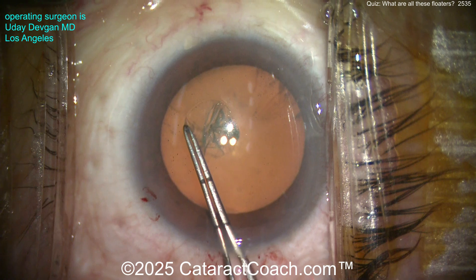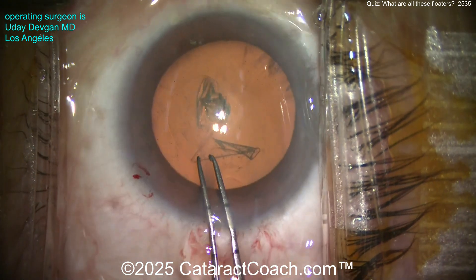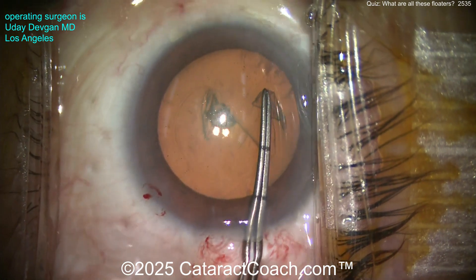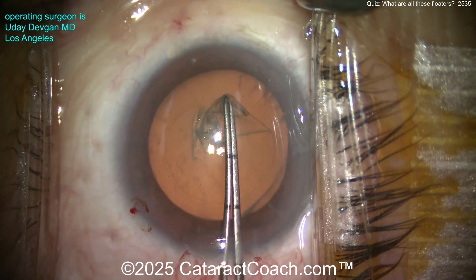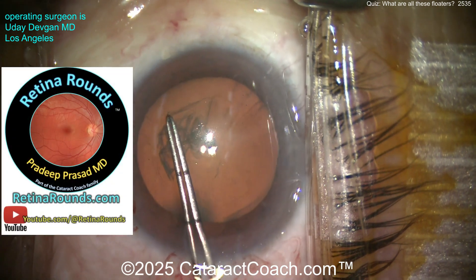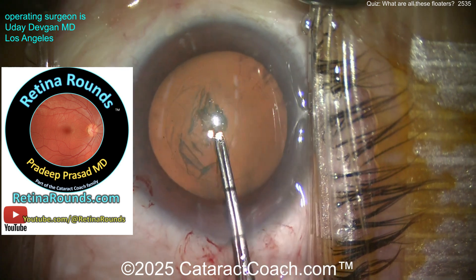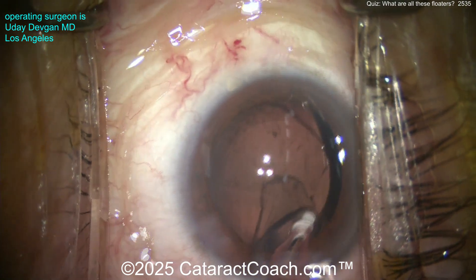That's loose zonular support — that's what that is. Now look in the vitreous; you can see through this cataract. It's not too dense. Look back there — there are no opacities, nothing floating around. Now there's the rhexis: a beautiful, precise five-millimeter capsulorhexis.